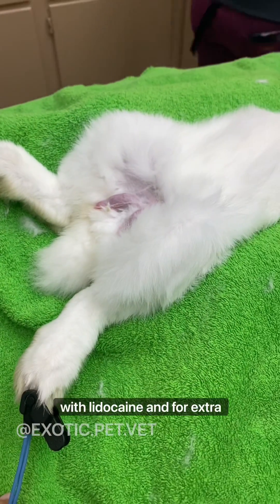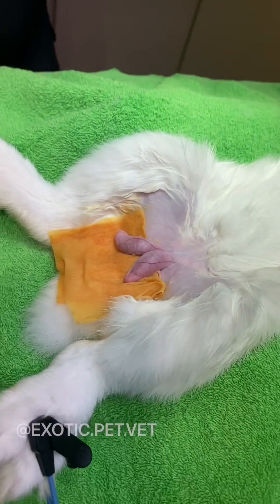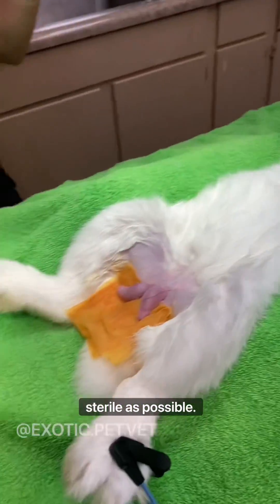Both testicles were injected with lidocaine for extra pain control. We place a sterile drape to keep our surgical site as sterile as possible.